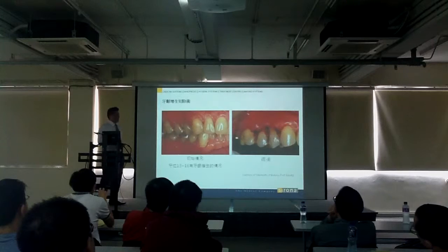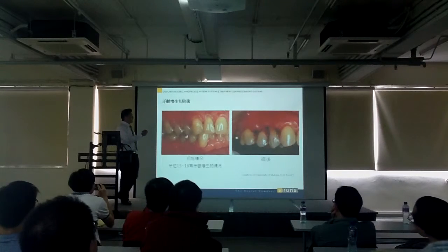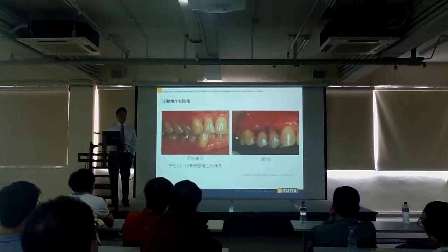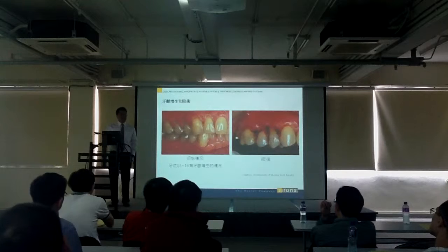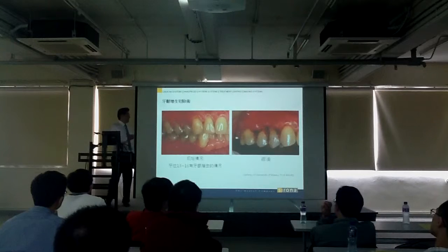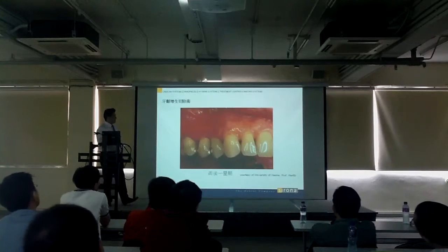This is hyperplasia. Right after the surgery, it looked like that. It looks kind of messy. But how do you treat hyperplasia conventionally? You take a bur? No, it doesn't work. There's nothing you can do. You just tell the patient to go and brush better. You really need to pay attention to this area because there's overgrowth of gum. It's easier to get periodontal disease, so take care of it. That's pretty much all you can do. But with laser, you can actually trim it down. 1 week later, pretty normal looking.